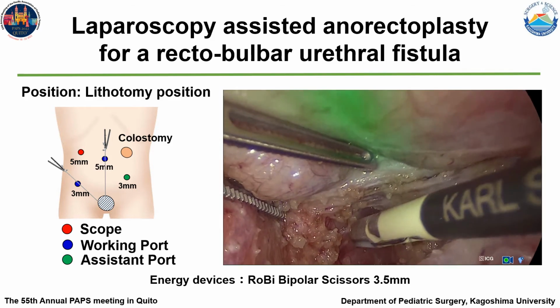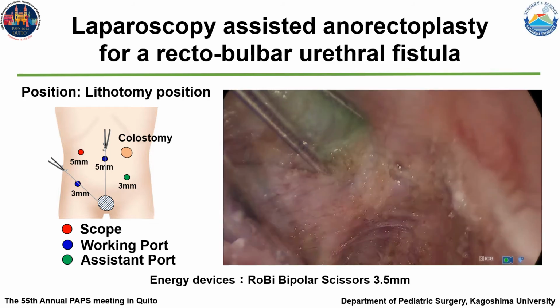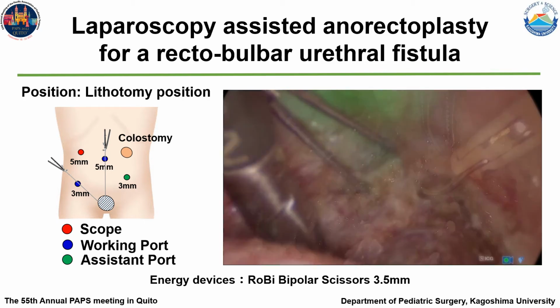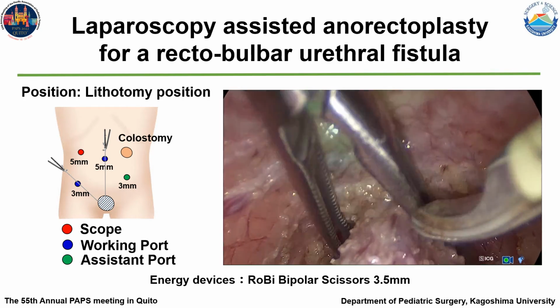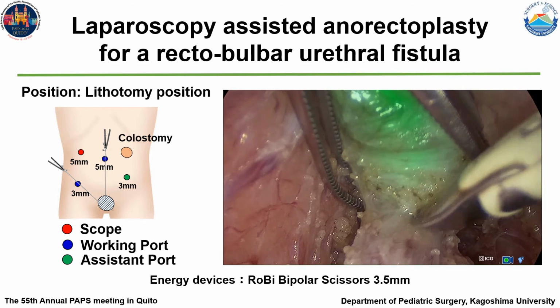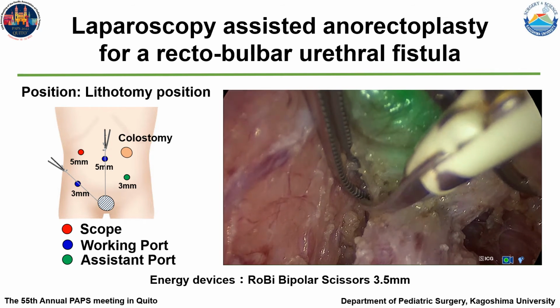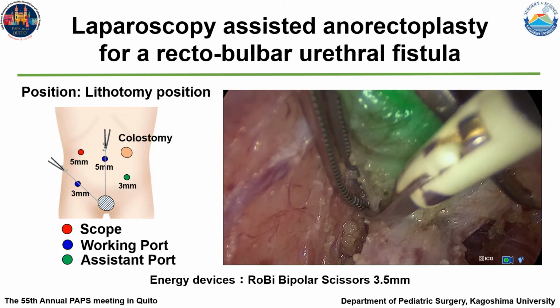Under general anesthesia, the patient was placed in the lithotomy position caudally on the operative bed, so that the operator could perform anoplasty at the end of the operation table. Our previously reported standard port placement is shown in the slide.